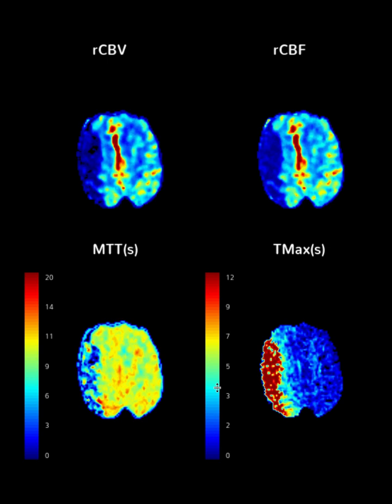Hello everyone, welcome back. In the series of top 5 diagnoses in emergency neuroradiology, now I'm going to talk about a stroke. Whenever you're going to work, you're going to see stroke cases that have different naming. They have a stroke code, a stroke alert, whatever it is.